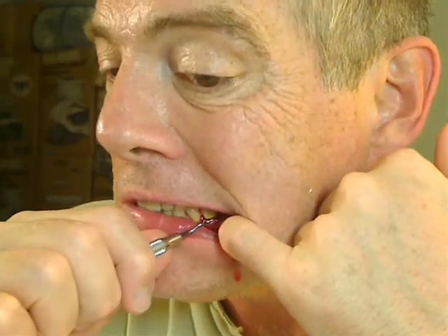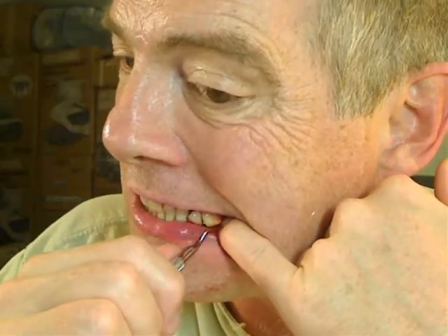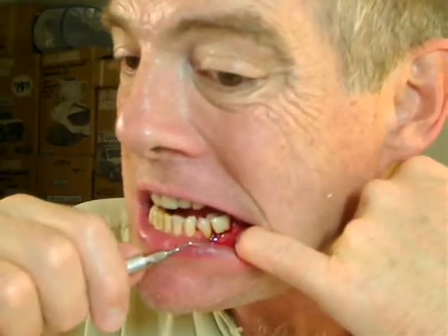The other important issue here — unfortunately the gum sort of broke loose too. Okay, so that's not good. It's going to fail anyway, so I'll just hold it in place. There's an abscess in there and that's just that. You've got to make your call: do you want to get rid of the abscess, or do you want to preserve a little piece of gum?